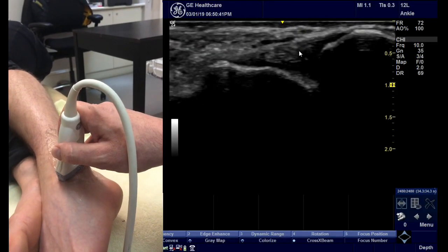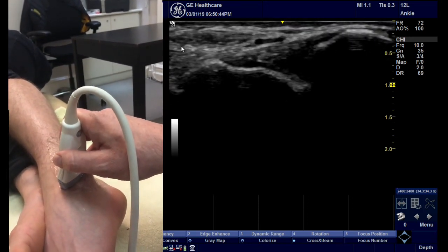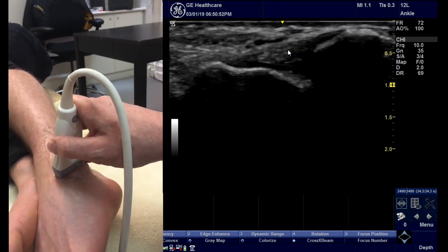Scanning the ATFL ligament here between the fibula on the right hand side of the screen and the talus here, this is the ligament in long axis. Quick scan all the way through it, and I'm going to do a dynamic test.